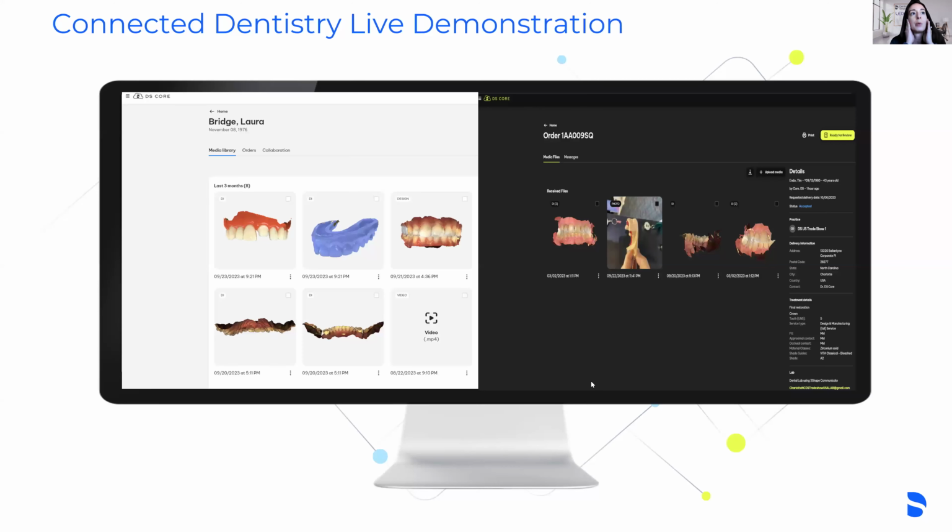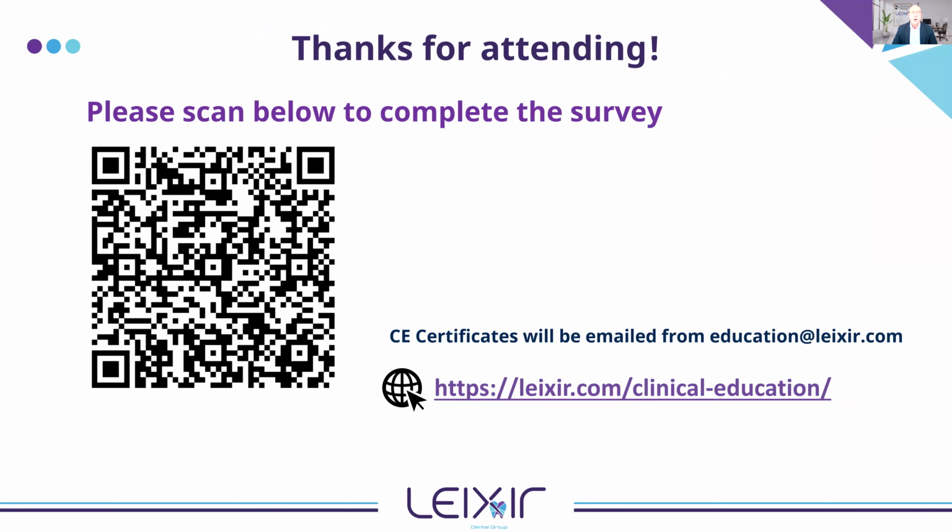Kent, let me ask you, what feedback have you heard on how quickly it's taking offices to upload the CBCT to DS Core? I don't have a specific answer on that one because it's going to come down to things like internet speeds. As we know, CBCTs are large files.